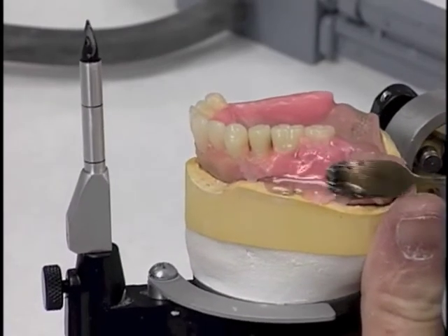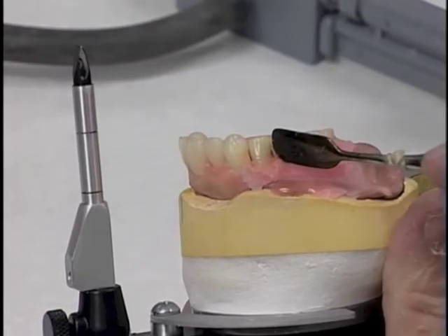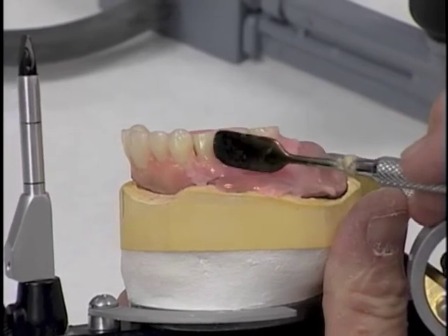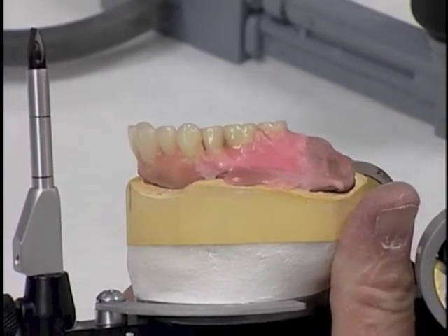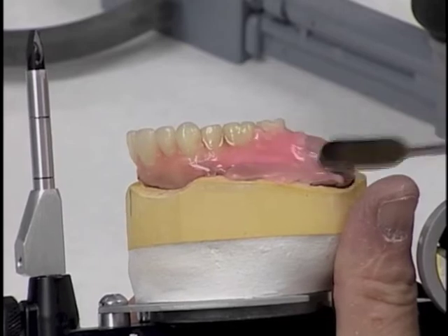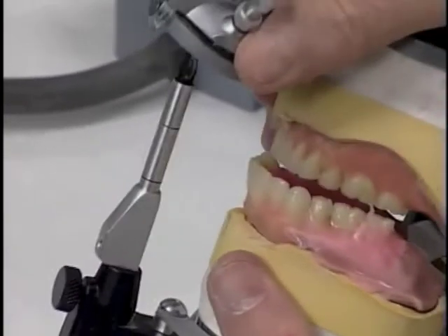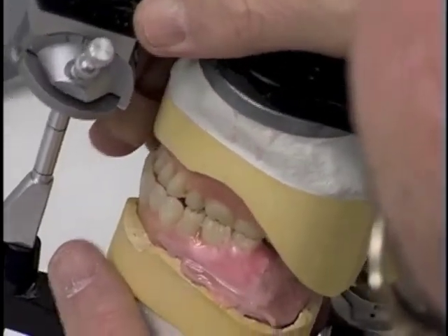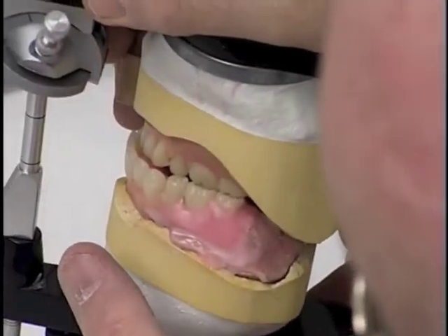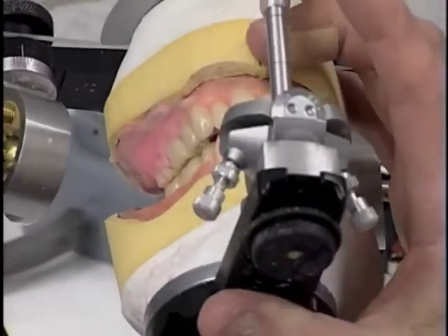Flowing this wax in. And then we'll check occlusion once again to make sure that we haven't moved anything. And it looks pretty good. And then we have about a 2 to 3 millimeter horizontal overlap of the posterior teeth.